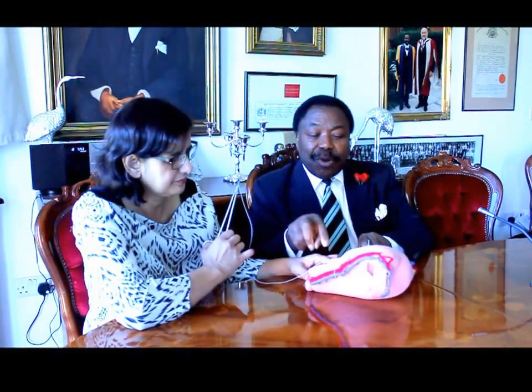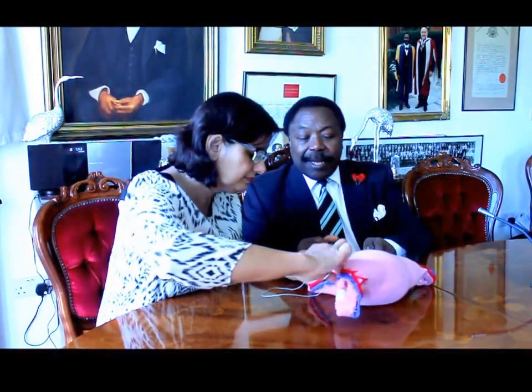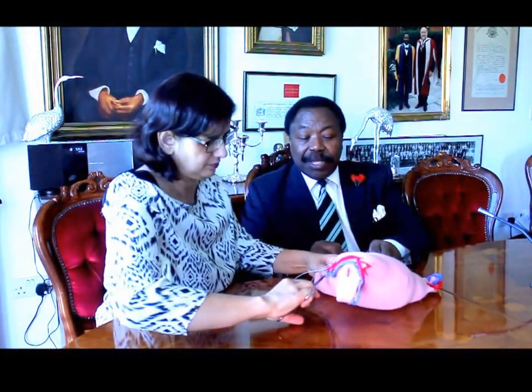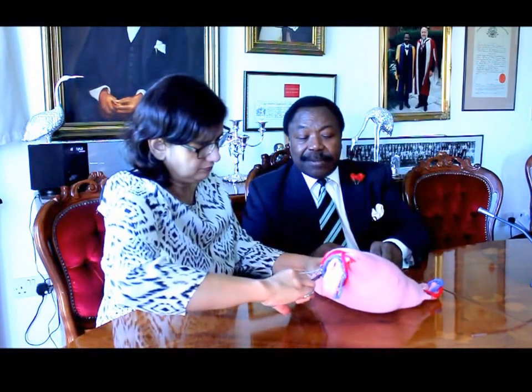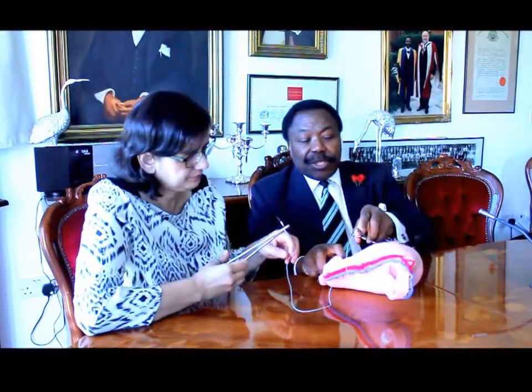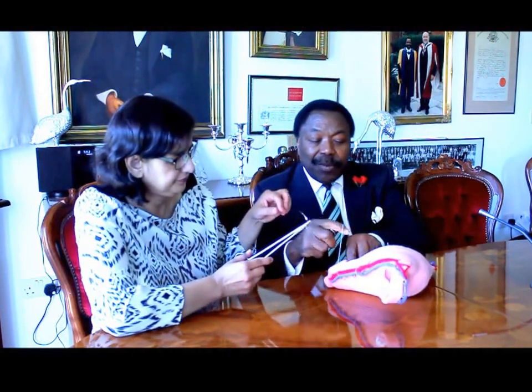Now the suture lies in the posterior wall of the cavity of the uterus, to come from inside out, 3 cm below the lower incision margin. By doing that, this suture will occlude the upper vascular system supplying the lower segment, and this one will occlude the lower, which anastomoses with that upper vascular pattern.